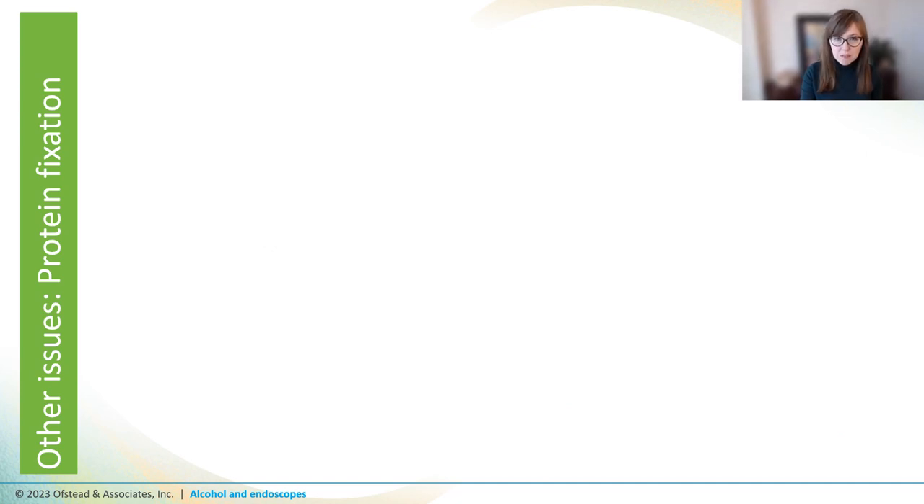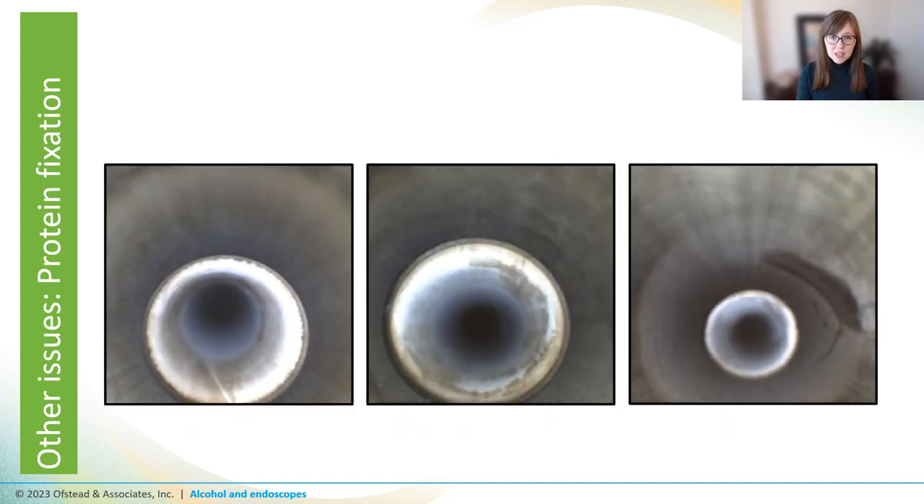So eliminating microbes is a bit of a bust, and drying scopes faster is also a bit of a bust. But there's more — alcohol flushes can actually make it harder to clean the instruments because alcohol is a protein fixative. That means your scopes could end up looking like these. All of these scopes were from a site that did manual cleaning, HLD, and alcohol flushes — all by the book — but their scopes still had brown residue in them that they couldn't remove regardless of how many times they cleaned.